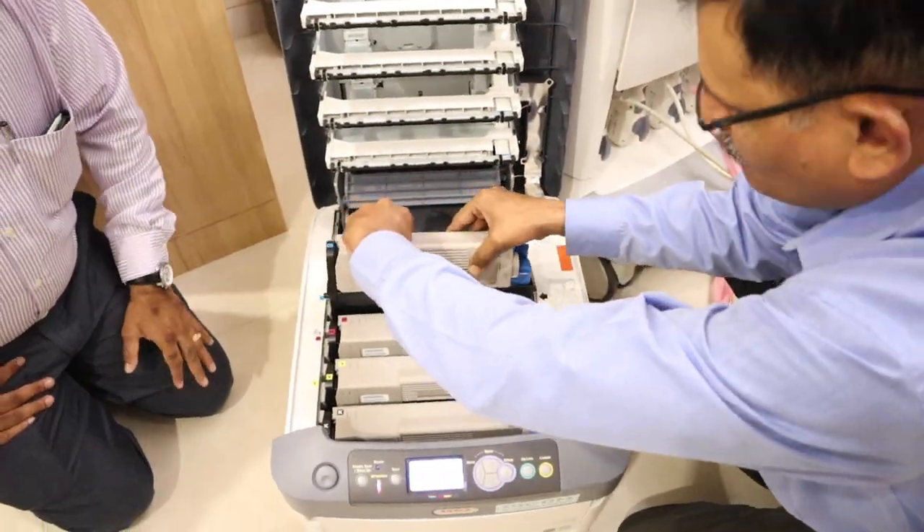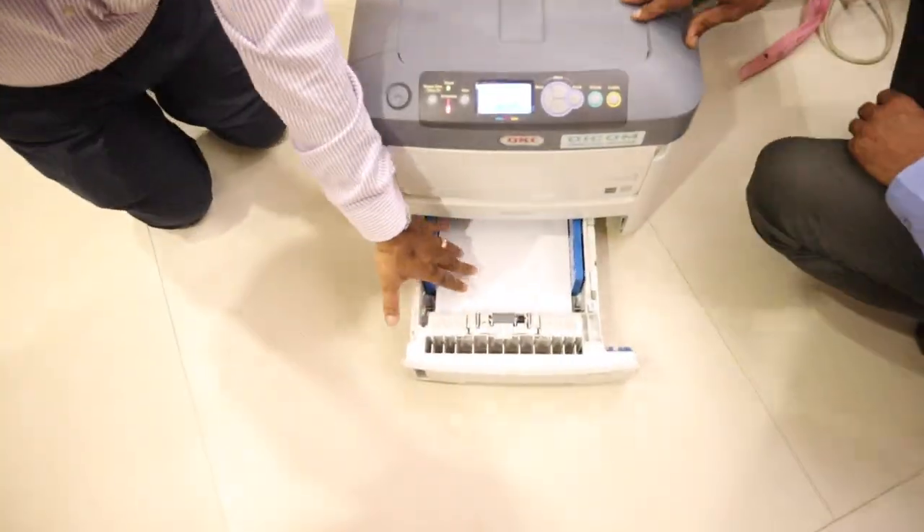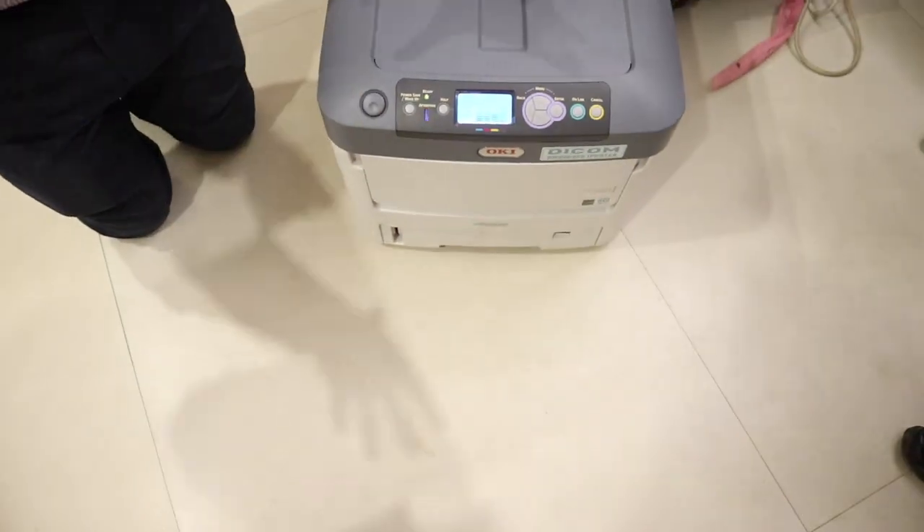This is DICOM, so basically it can connect directly to your CT or MR machine and you do not need any intervening computer or intervening software to print these pictures.